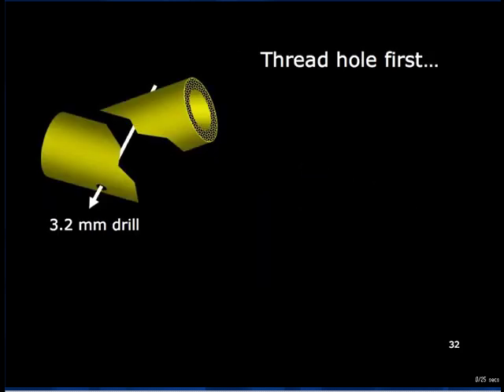Very rarely, if there is a narrow spike at the tip of the far fragment, which would be difficult to drill optimally through a sleeve in the gliding hole after reduction, a technique can be used whereby the pilot hole in the far fragment is drilled first from inside out. The post of a specially curved drill guide is then engaged in the pilot hole and the fracture reduced.